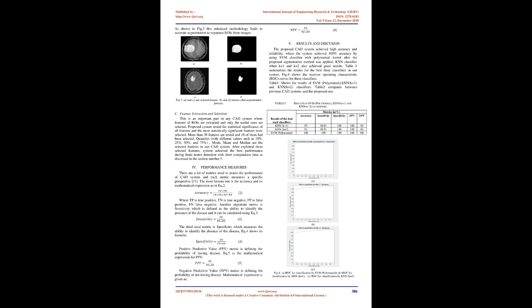B. Segmentation. Segmentation can be defined as the process where the ROIs are detected and extracted [11]. In this stage, this paper proposed an enhanced method for automatic segmentation.